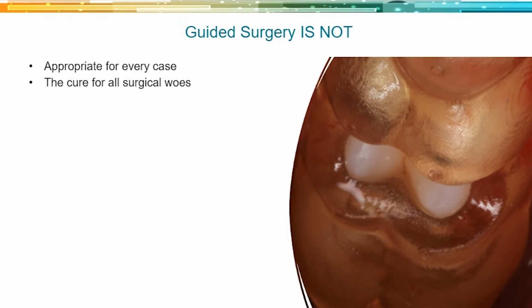You can still have issues with bone. You can certainly still have issues with grafting or pulling teeth. Implants fail at the same rate doing it guided versus non-guided. So it's not the cure. It's not going to make you 100%. It's certainly not a replacement for skill and experience. I know a lot of people start guided, or their mentors tell them to begin guided. I usually lean the other way and say start partially guided.